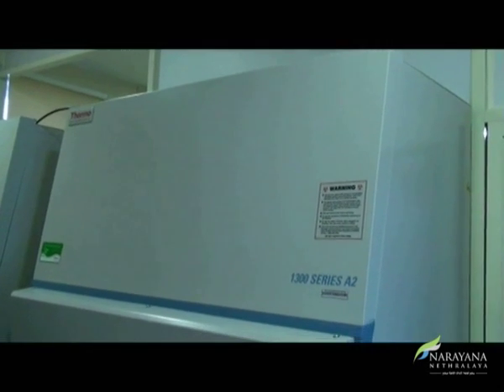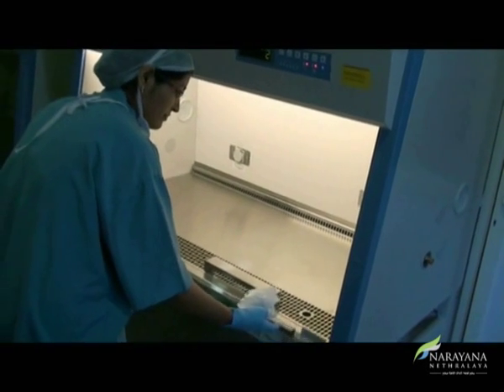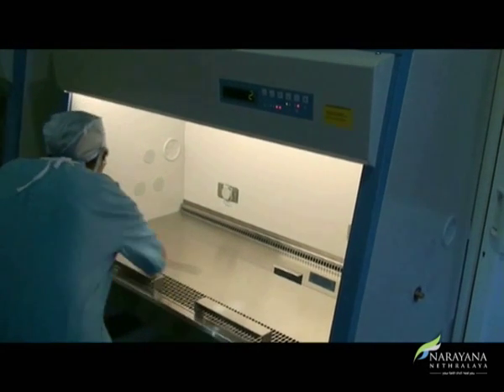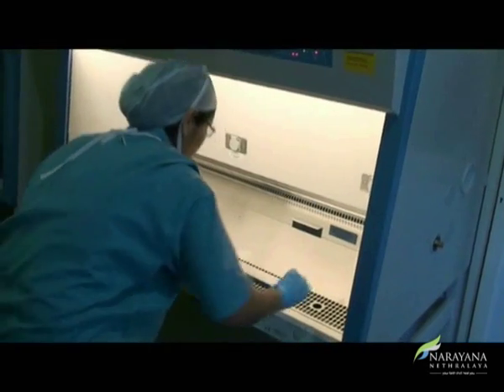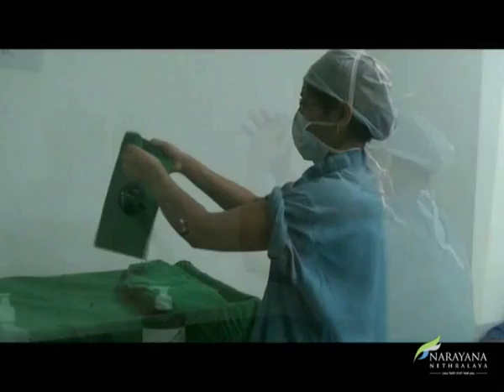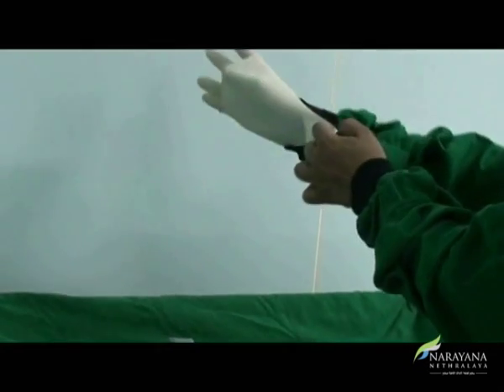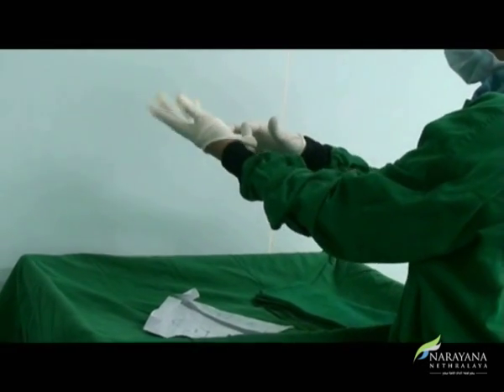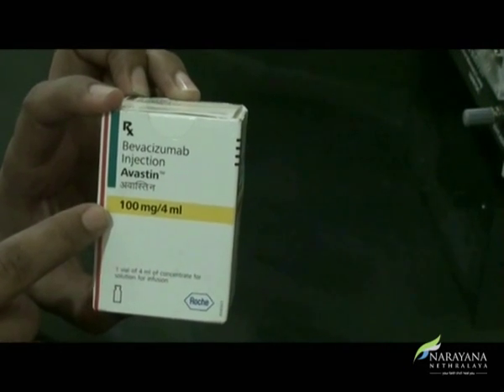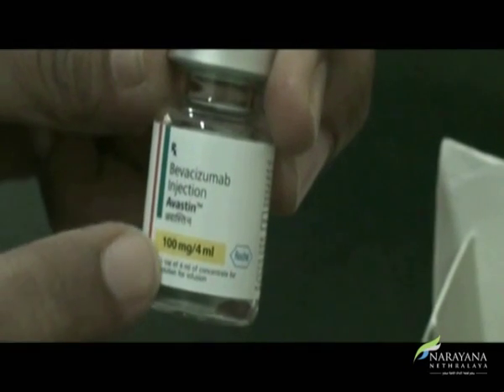Now we come to preparation of multiple doses of Avastin from a single 4 ml vial, which should ideally be done in an operation room with laminar flow or in a laminar hood. Preparation of the hood comprises cleaning the surface with spirit, and after cleaning, the lid is closed back. The person doing preparation should scrub for at least 3 to 5 minutes — no shortcut to be taken for sterility. Ensure the mask is on and powder-free gloves are worn. Verify the name, quantity, batch, and expiry on the box before opening and again check the same on the vial. Also ensure maintenance of cold chain during each step of transport.